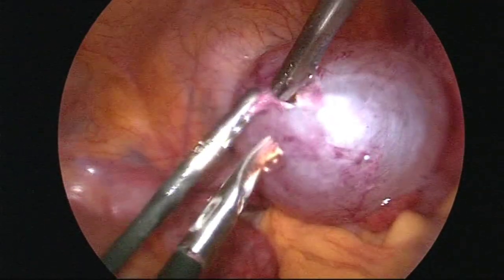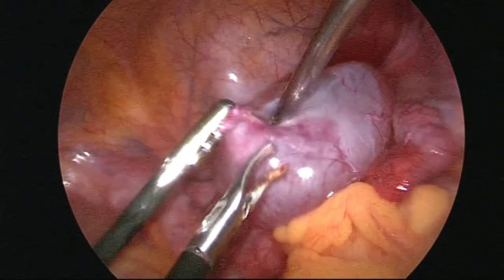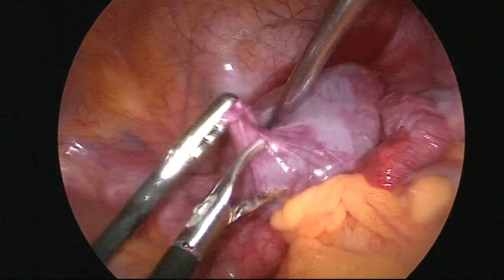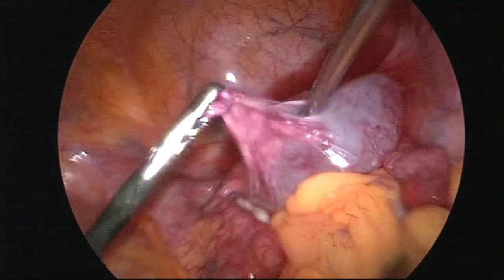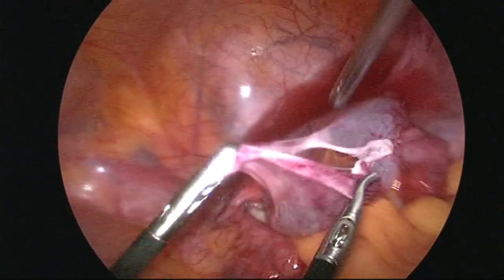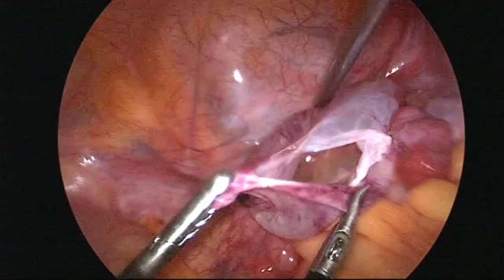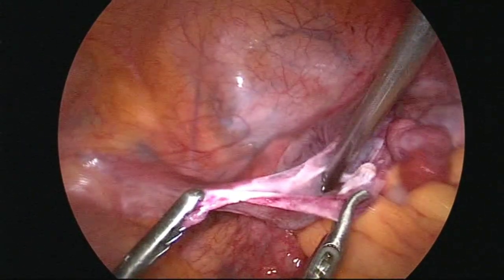Yes, it's punctured. Now I will suck it out. You can see clear fluid inside the cyst.